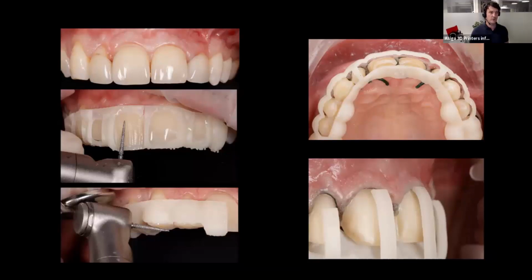What material do you use for the mock-up? So I'm using the denture tray for the model, and then I'm using the PVS key on top, which I didn't show on the slide, but we actually cure it under pressure in a little pot. The Asiga models are so beautiful, because we're printing the HD version from the planning center, the digital wax-up, which is a beautiful HD version. So when we print it, there are a couple of weak points. If you have a very, very accurate model but a really substandard key on top, you've sort of missed out on this beautiful model.